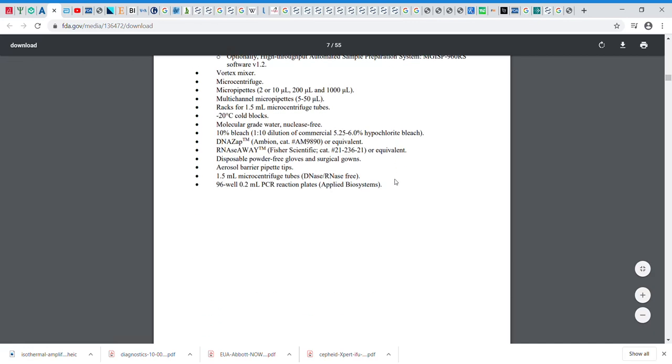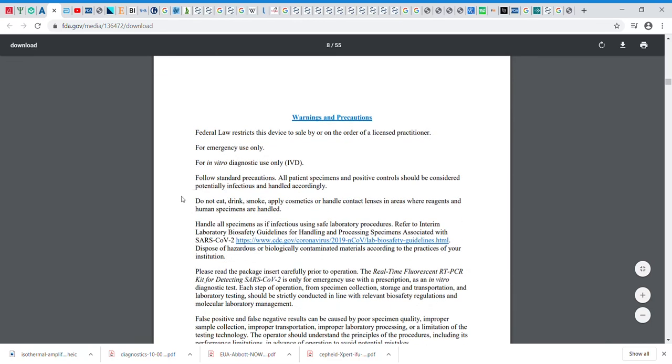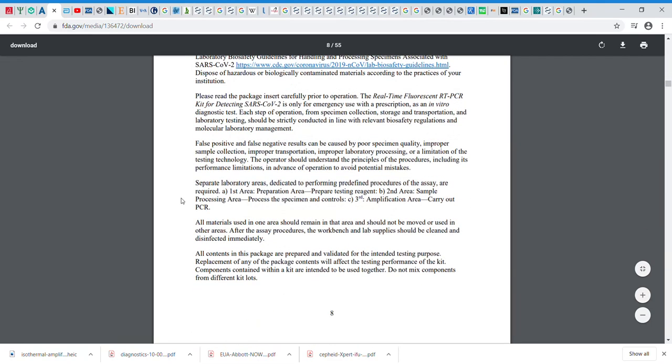They'll work with either one. You have to have some of these things for cleaning. DNA Zap is something that destroys DNA. RNase Away destroys RNA. Lots of these little things. Lots of details.